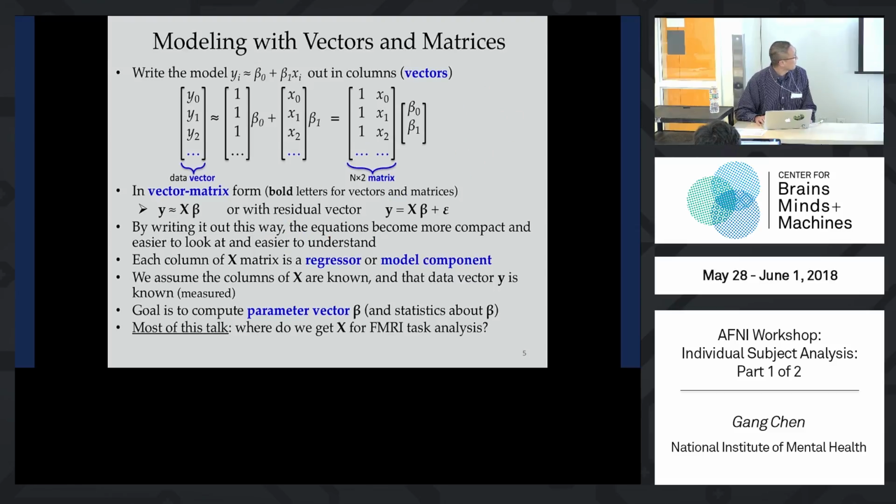But for FMRI, we deal with a different framework in the sense that X and Y are not just simple pairs. Especially for X, there's some pattern. The X is our regressors. It's something we put in the data. That's your experimental design. For example, at 10 seconds, you ask the subject to do something, so there's a pattern. That pattern we usually call several regressors.